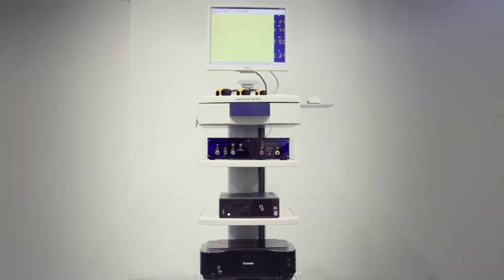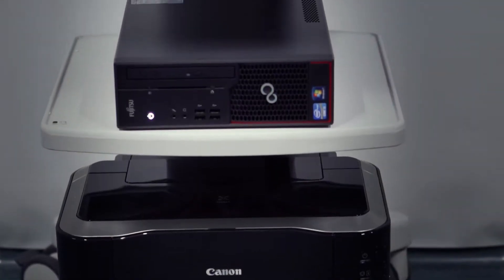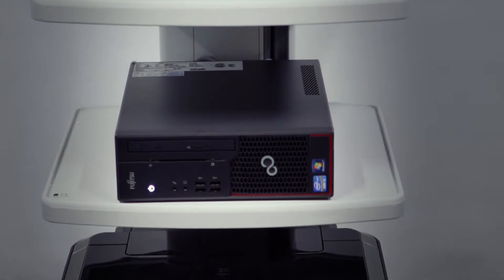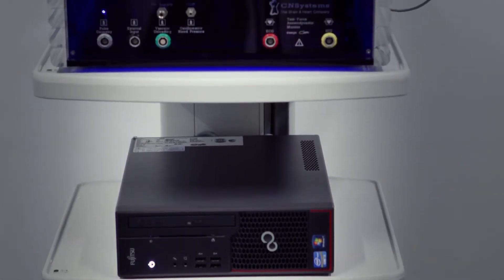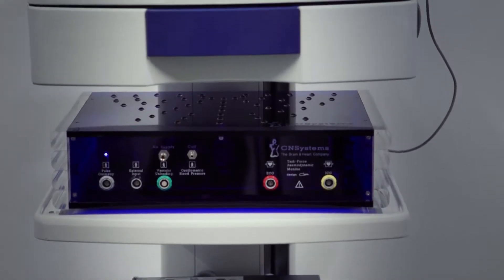The Task Force Monitor is setting new standards in hemodynamic monitoring for use in cardiology, electrophysiology, neurology, research, and all situations that require full hemodynamic monitoring without cannulating the patient.